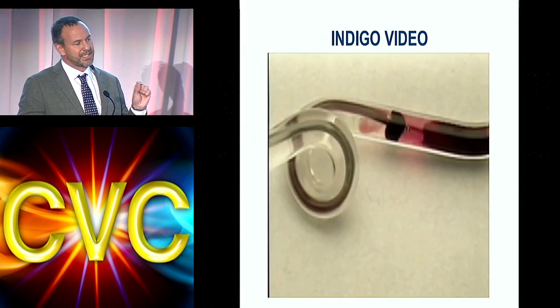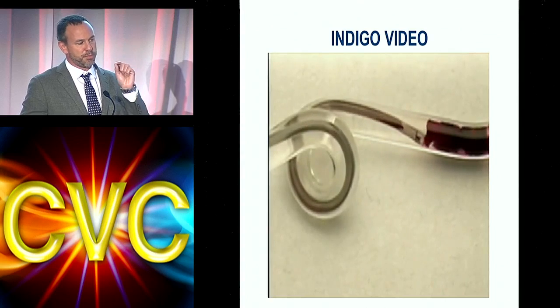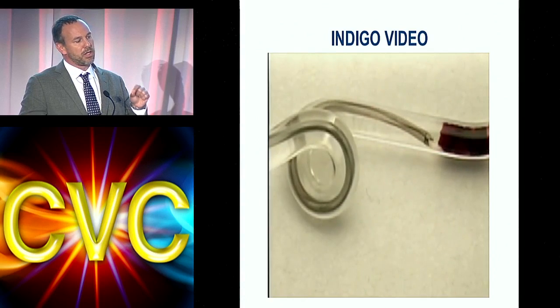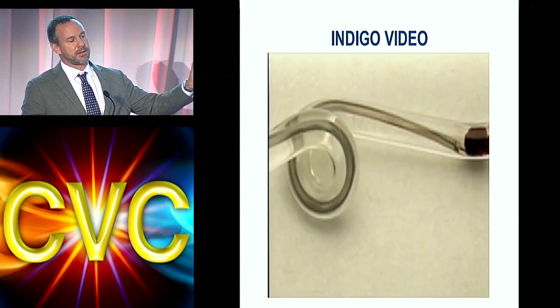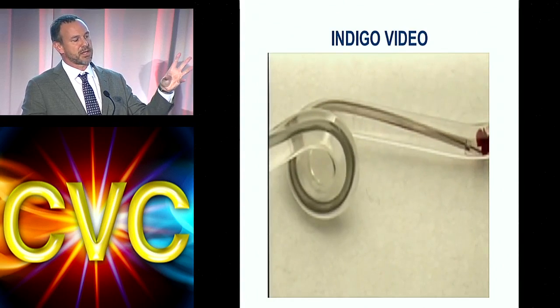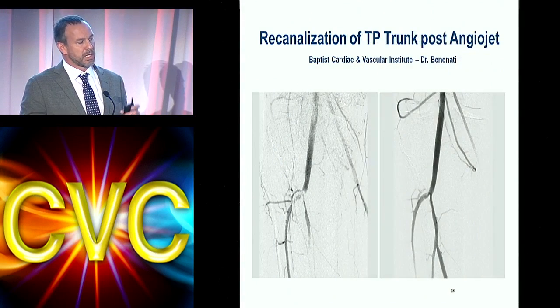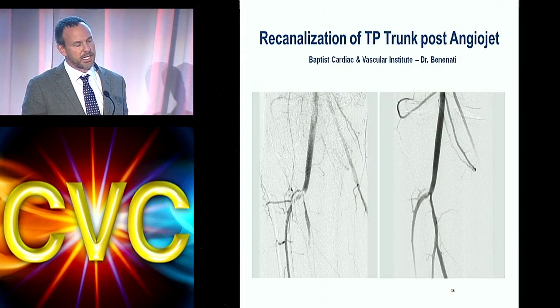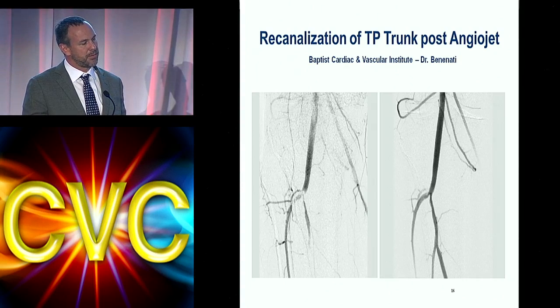Again, you want to go slow. That's the aspiration. There's a very small olive on the tip of that. And you basically just push that wire with that little olive there, and that helps break up the clot into smaller pieces. You even saw it where it's behind the catheter, and then it sucked up the clot right up along and into the catheter. By really going slow, starting proximally and going distally, you suck it out, and then you decrease the risk of distal embolization.